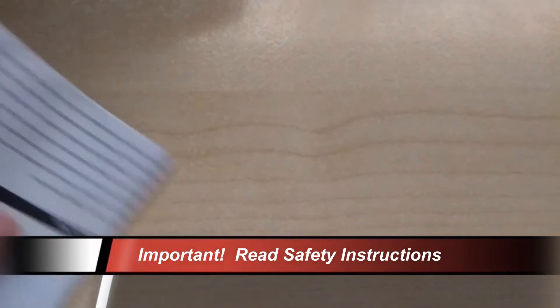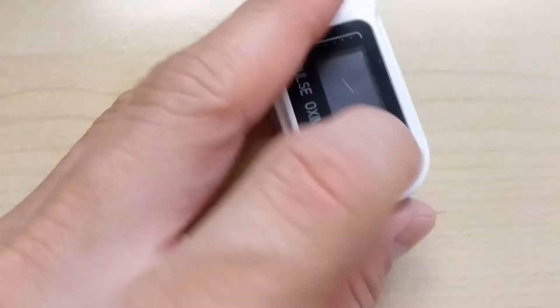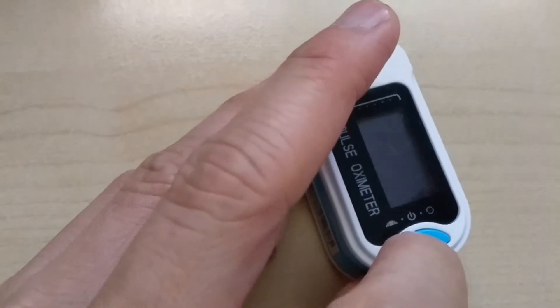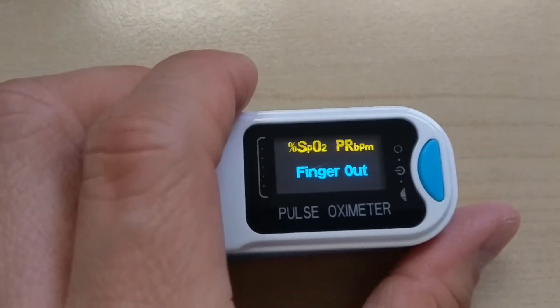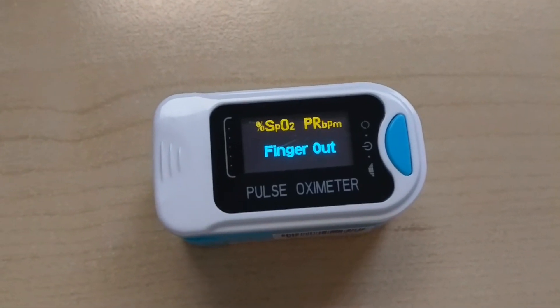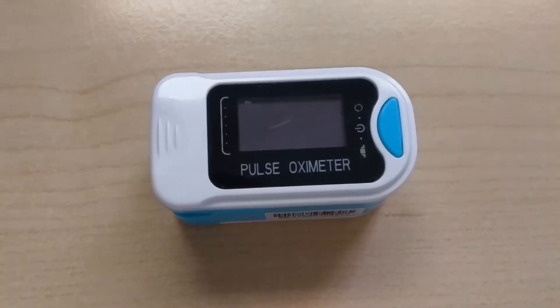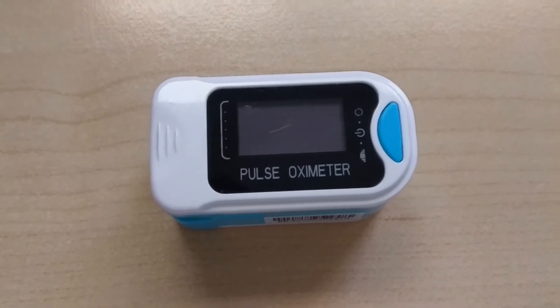Having said that, let's put that away and actually do a test. First, you can power it on by pushing the blue button. It tells you the version number and it detects that your finger is out. This model is very aggressive at saving power given that it only uses two AAA batteries, so it powers down whenever it thinks you're not using it.